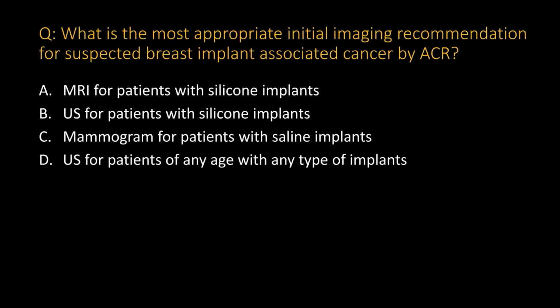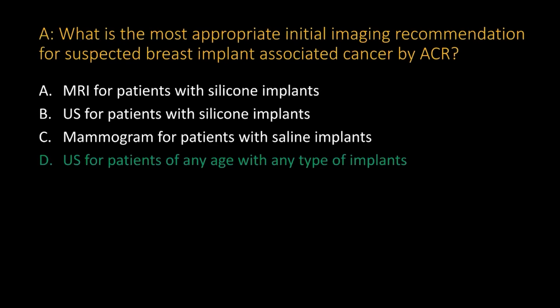I believe this is the last question. What's the most appropriate initial imaging recommendation for suspected breast implant associated cancer by ACR? The correct answer is actually D. Ultrasound is recommended for patients of any age with any type of implant. I know lots of you chose A. I think in real world practice, a lot of physicians just order MRI.